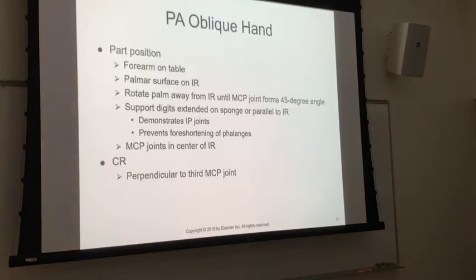So you're going to collimate, collimate, collimate, and what are you going to do? Chop the thumb off. You're going to chop your thumb off, right? So make sure, and it happens sometimes on PA as well, that you don't neglect the poor thumb. You don't want to scrunch the thumb in like that, so keep it separated, but make sure that you don't collimate the thumb off on the PA or the lateral, okay? So make sure you pay attention to the thumb.